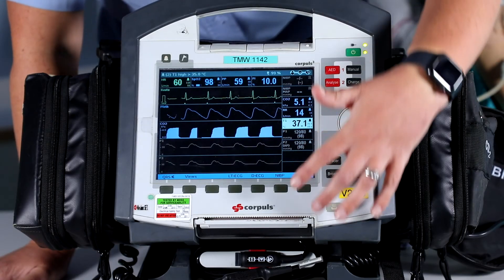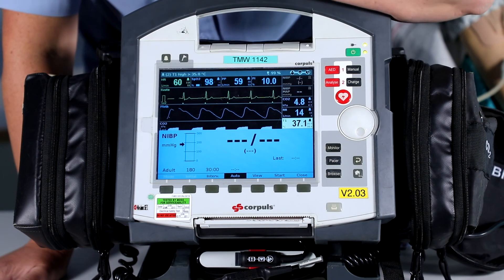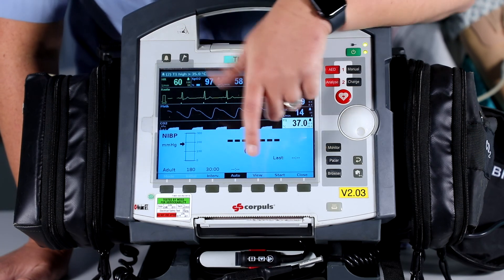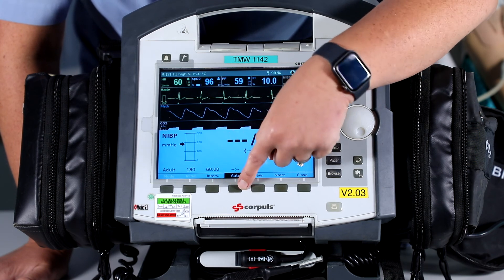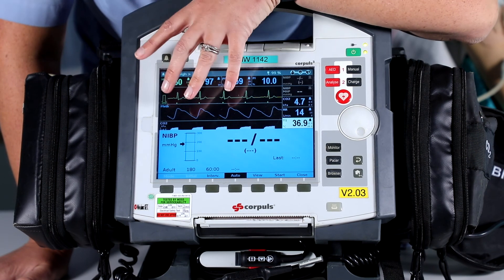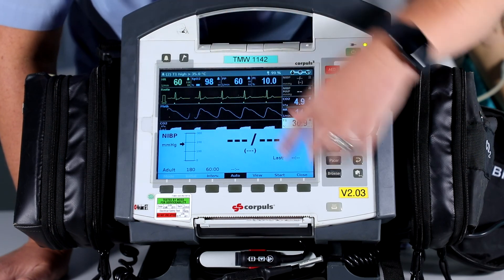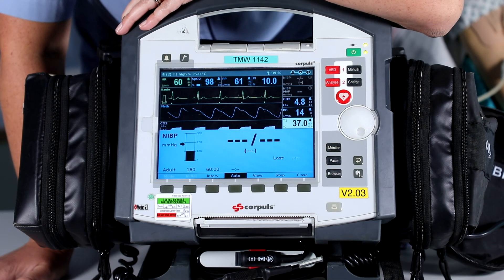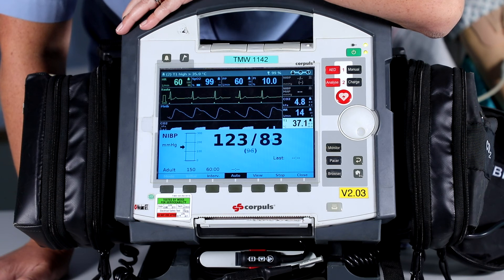The next function we're going to cover is non-invasive blood pressure. Press the NIBP button at the front of the screen — the screen will come up showing where we're going to get all our results from when we've done a non-invasive blood pressure. To change a few things on here, we can change our interval time for our blood pressure. If we wanted to perform a non-invasive blood pressure, we press the start button, and as you can see this is going to give us a result.